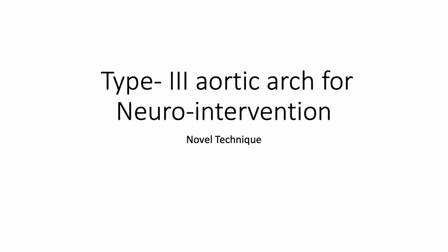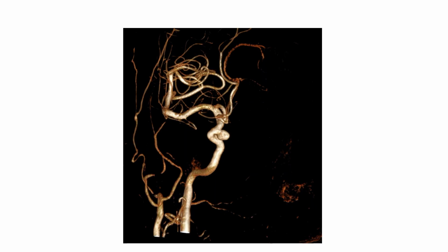Now let's keep going further and understand the type 3 aortic arch and a technique that we're going to describe, which can be very, very useful. Now, I want you to understand this is something that we have been doing for some time. We find it extremely useful and we call it the distal anchor technique.